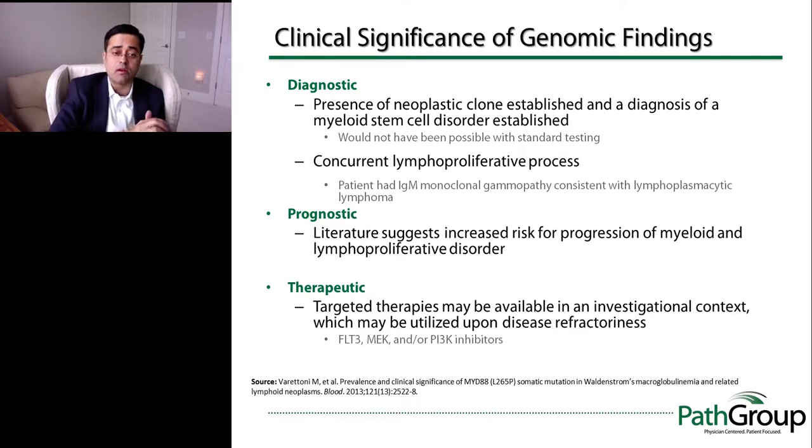therapies not work. But the other really fascinating thing was that we made a second diagnosis of early lymphoplasmacytic lymphoma. It turned out that this patient had some other clinical findings, including an IgM gammopathy that would indicate early lymphoplasmacytic lymphoma. But we also found a MYD88 L265 mutation, and then in conjunction with the lymphoid aggregates that I showed you earlier, we were able to let the clinician know that this patient actually has a second malignancy. And really, it was just game-changing. Not only were we able to render one diagnosis, we were actually able to render 2 diagnoses.